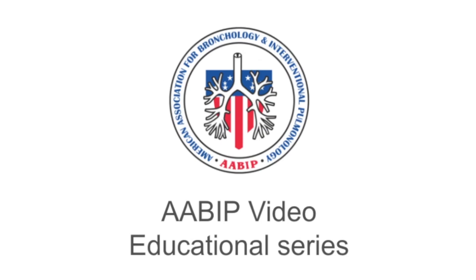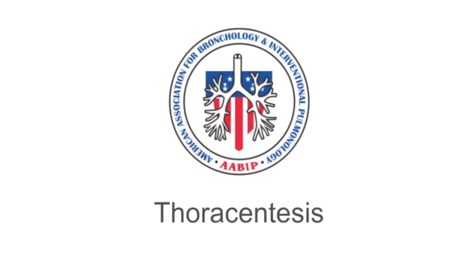AABIP video educational series. This video will demonstrate the technique of ultrasound-guided thoracentesis.